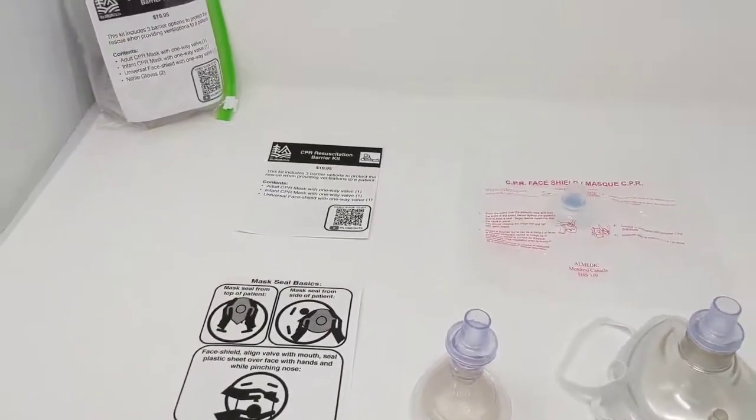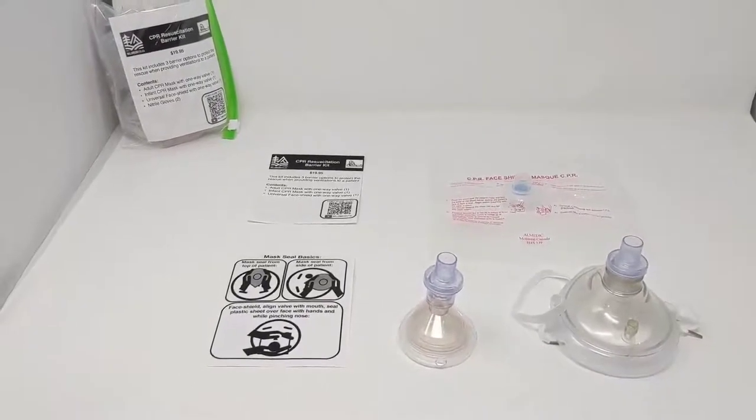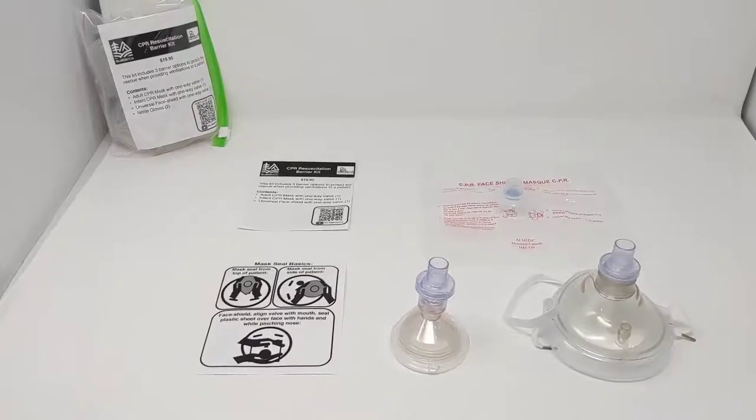It's all included in this resealable poly bag. This is our CPR resuscitation barrier kit and is now available at wildmedkits.ca.